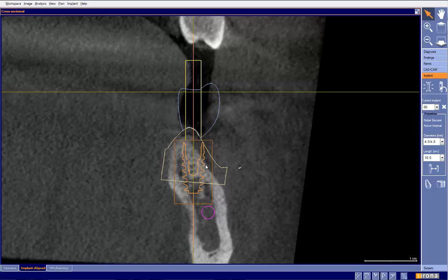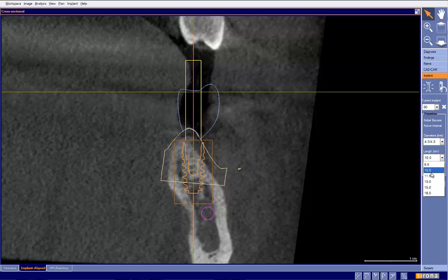When I'm doing some lateral grafting at the time of placement, I do plan the implant subcrestal just in case I have some bone loss from the procedure itself. But based on something like this, I'd be pretty confident doing the grafting at the time of implant placement. I would place the implant, reflect a full thickness flap, decorticate, and graft. You would have to do a nice release here to get primary closure of that tissue and place a membrane.